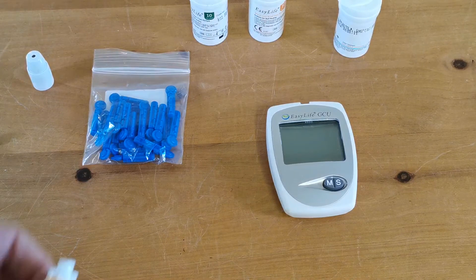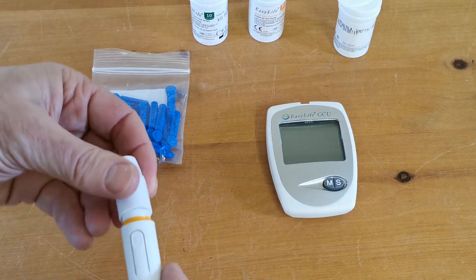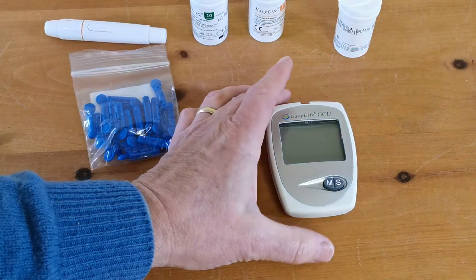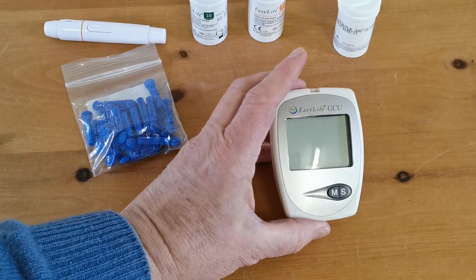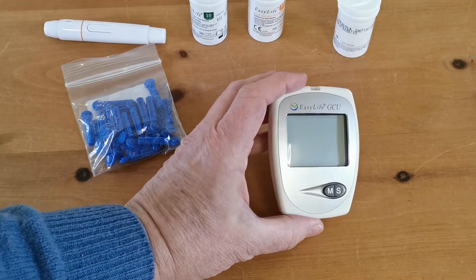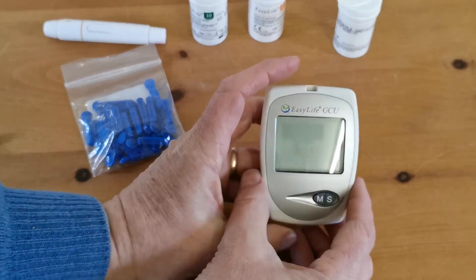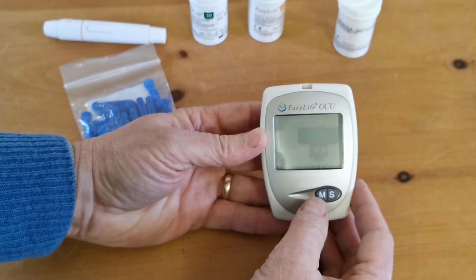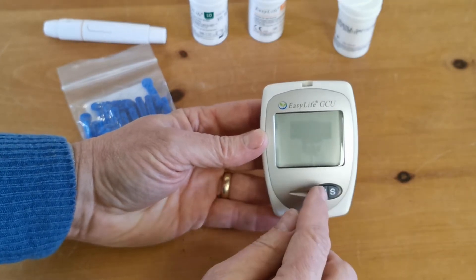Now the second function we're going to show you on this meter - just put the cap back on that lancing device - is the memory function on the meter. If you've read the pages and pages of instructions that come with this, you'll know it's got a memory function, and to pull up the memory or recall of previous tests you've done, it's the M button on the front.